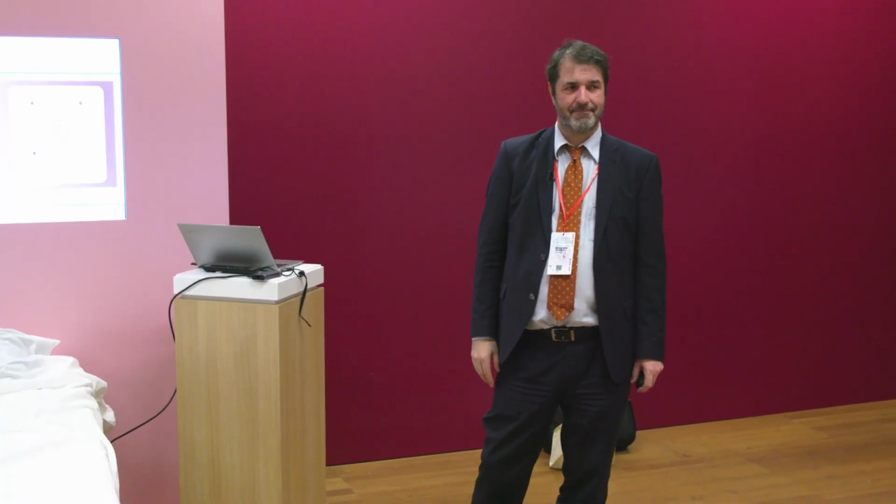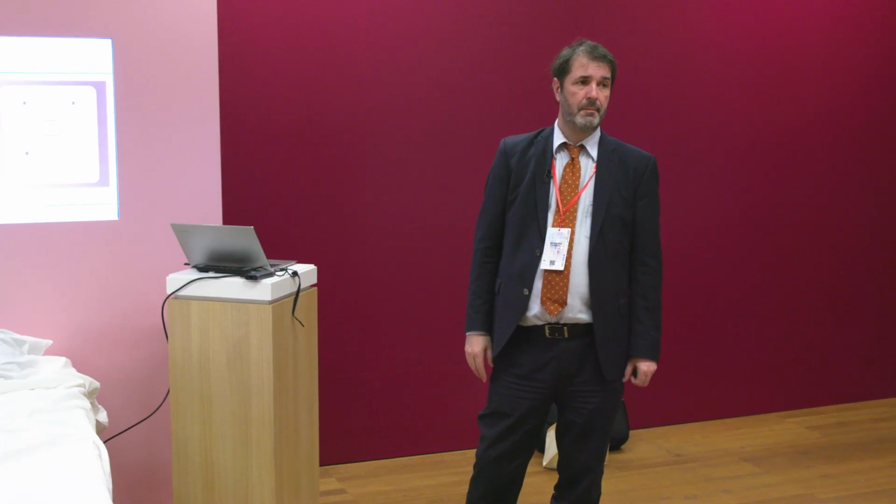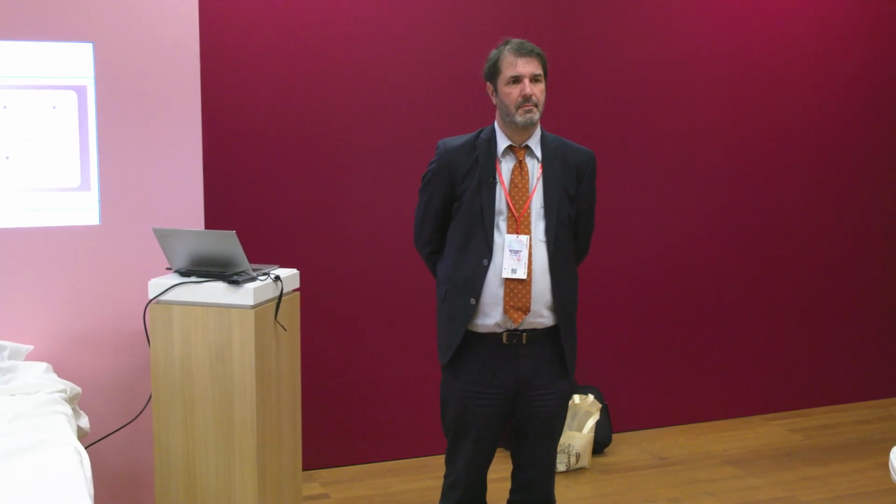So with fusion, you can take the benefits of each modality. You can take the advantage, for example, of CT, MR for, let me say, tissue mapping, and then using ultrasound for live ultrasound imaging. This is also one of the key benefits, having something static and something live just to overlay contrast information or color information. I think this is a very fantastic opportunity. It's brilliant. Okay. Well, thank you very much.